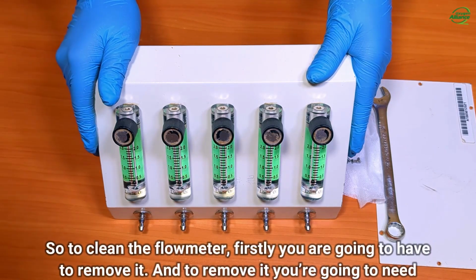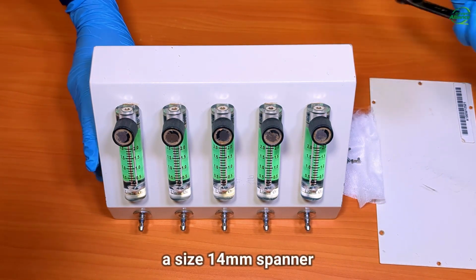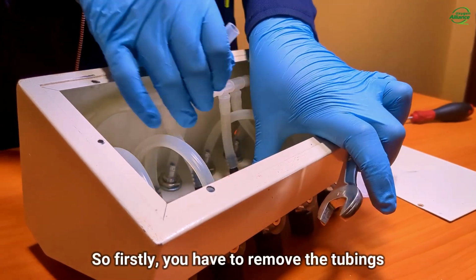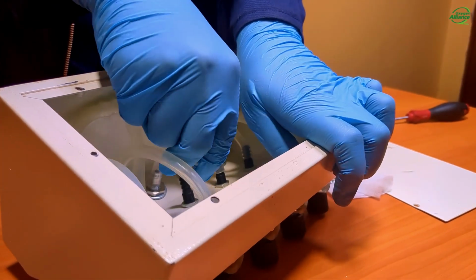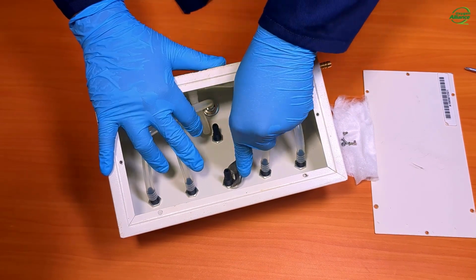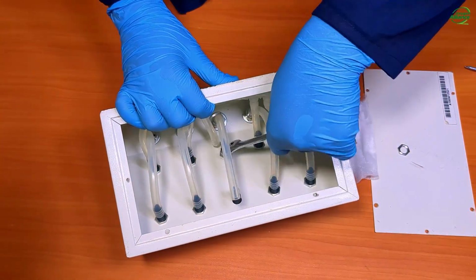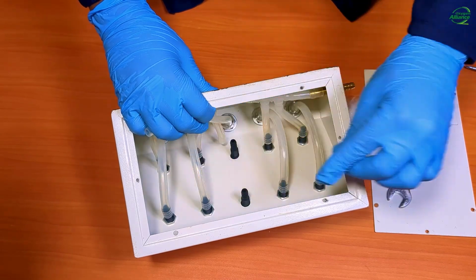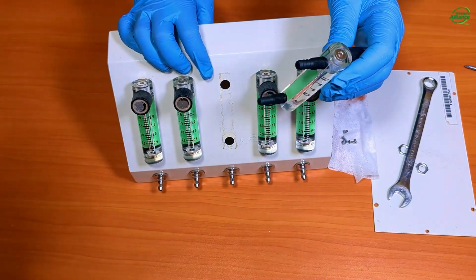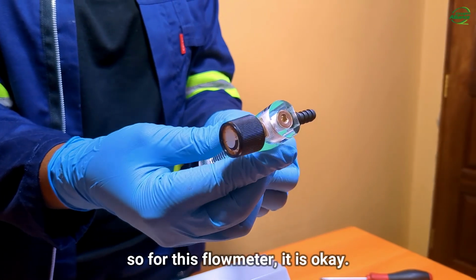So to clean the flow meter, first you're going to have to remove it. And to remove it, you're going to need a size 14mm spanner. So first you have to remove the tubings. And then, once you have removed your flow meter, you can check if it has any cracks. So for this flow meter, it is okay.